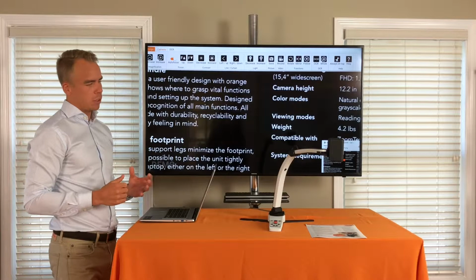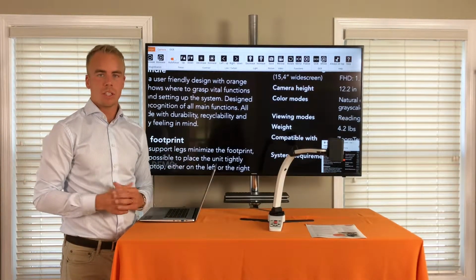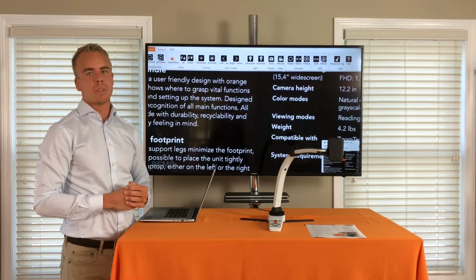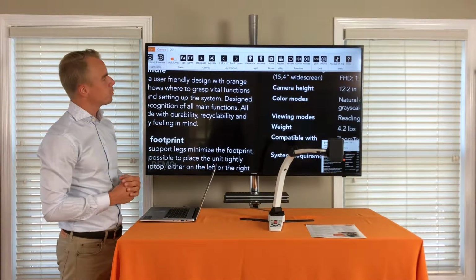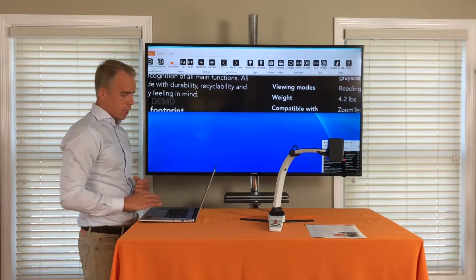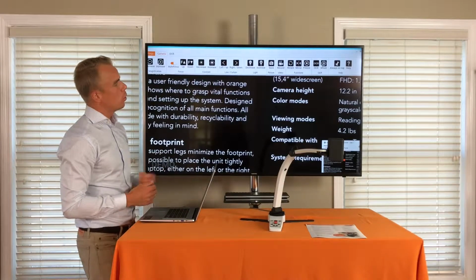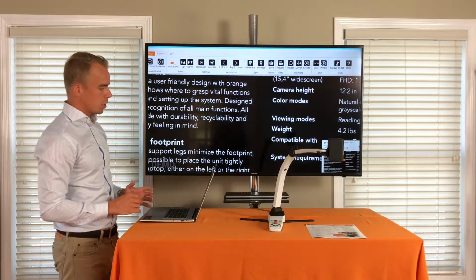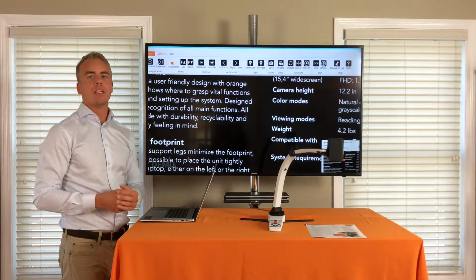That can be very useful either to save your notes or your text or your books, but also when you do the distance viewing to save what's on the teacher's board or when a friend is having a presentation for you. Another good feature will be the split screen mode. So I can split the screen by pressing the 8, or again it's up all the way to the right there in the icon bar. So I can split the screen and use another program at the same time, maybe taking notes.